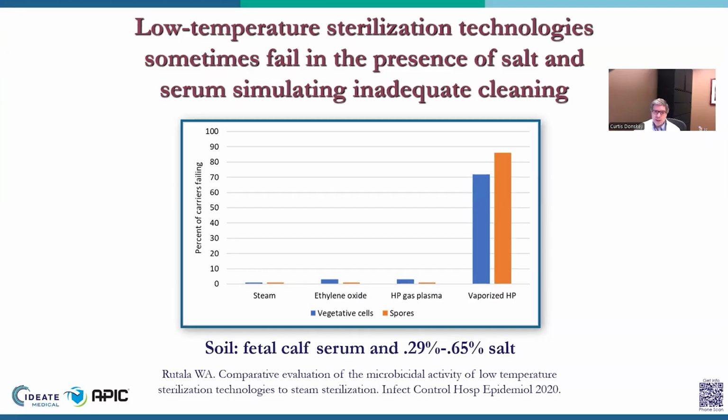And what you can see here is that steam sterilization did not fail to reduce vegetative cells and spores to undetectable levels, and that all 3 of the low temperature sterilization technologies, however, could be made to fail in the presence of a salt and serum challenge.